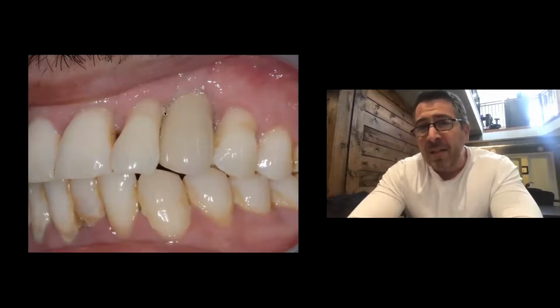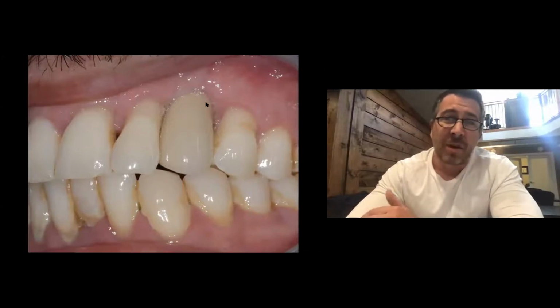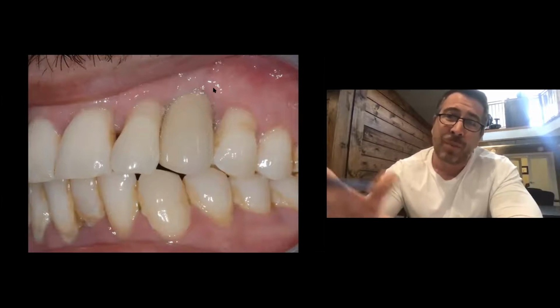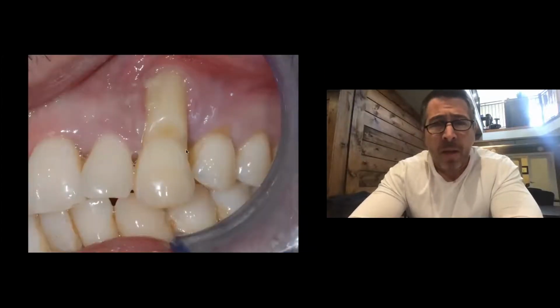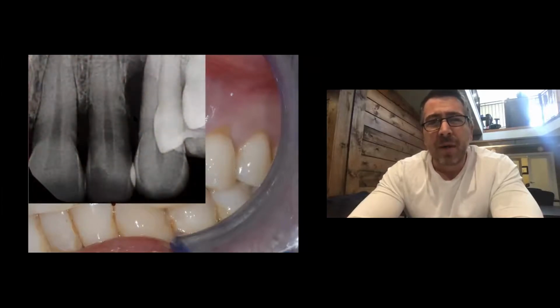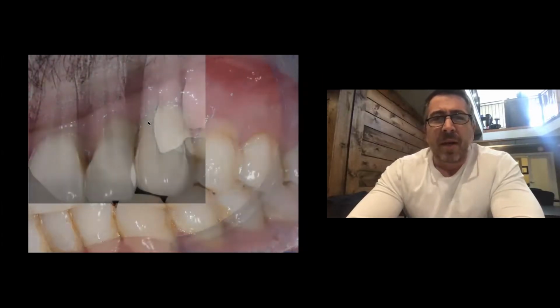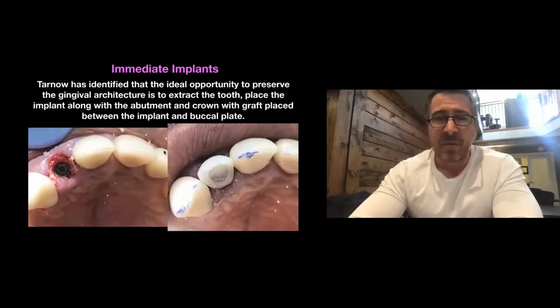But I predicted the fact that the papilla was going to shrink on us because we looked at where our starting point was with his height of bone. And in my zenith, I think ended up in a pretty nice position. And that was only because we did some reconstruction first and made sure that the implant was pushed where? As palatal as possible to let this facial tissue come down towards the palatal. Starting point, predictable. Yeah, look at the height of bone where it is on the radiograph. And then we end up with a fairly decent result considering how dramatic that case was.